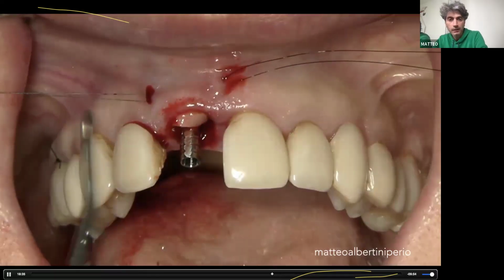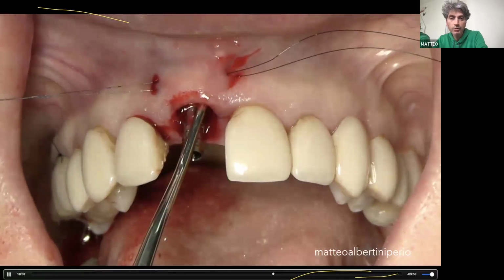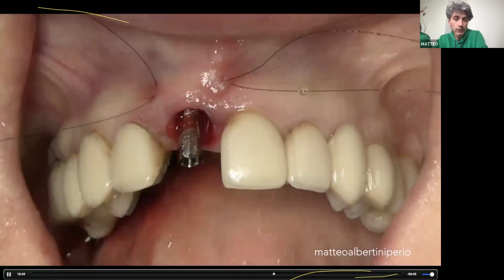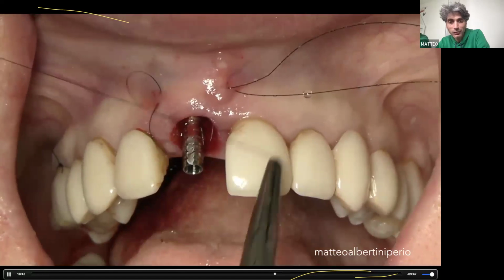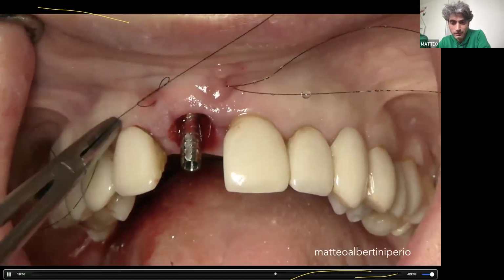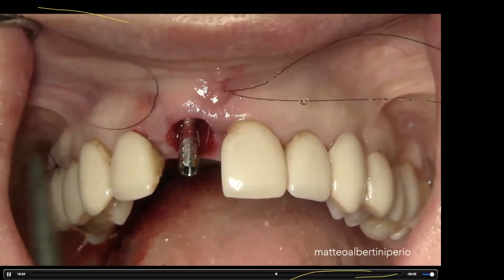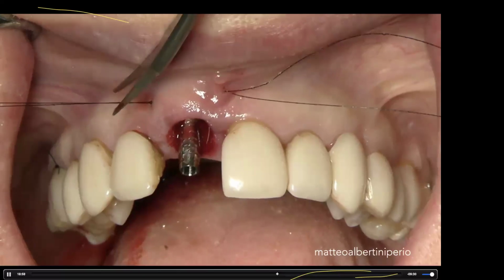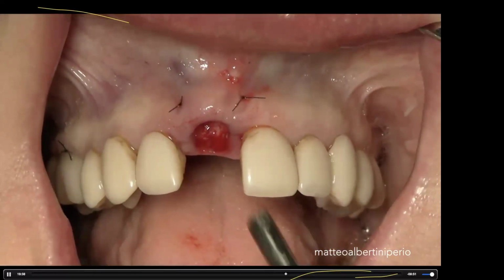Okay. The soft tissue graft doesn't have to be positioned too apically. If not, you couldn't see the effect of the soft tissue graft. Когда мы укладываем соединительный трансплантат, сформированный кармашек, нам не нужно, чтобы он оббежал слишком апикально, потому что иначе результата от его применения мы с вами не увидим самые важные части, которые находятся у шейки имплантата.